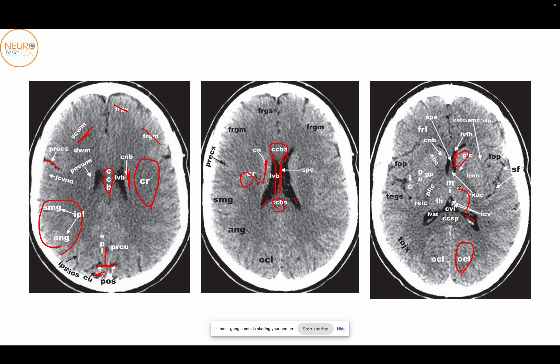At the same level, you will also have this big grey matter which is the thalamus. You can also make out this triangular grey matter which is the lenticular nucleus and the globus pallidus. In between the lenticular and the caudate nucleus head, you will have the anterior limb of the internal capsule, and in between the lenticular and the thalamus, you will have the posterior internal capsule. You have the thalami connected to each other by the massa intermedia, and just posterior to that are the internal cerebral veins. You can also see the insular cortex, the sylvian fissure, and the frontal and superior temporal operculum.